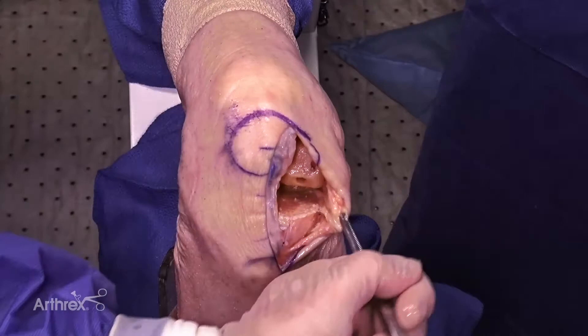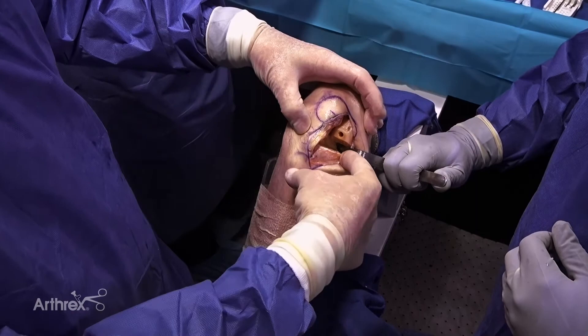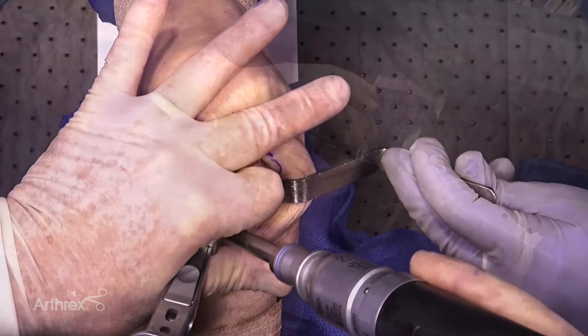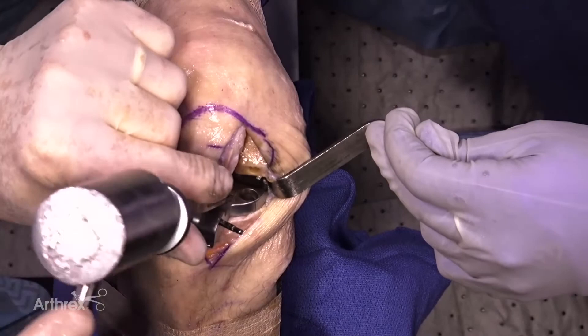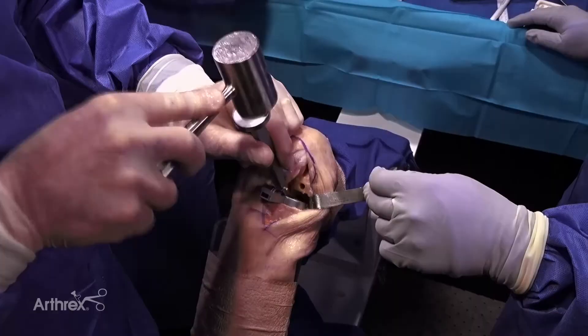Femur's done — now we're turning our attention to the tibia. I take the Z retractor and reflect any tissue away because I want to be on the posterior medial corner. I externally rotate the tibia just a little bit. Through a small incision with adequate reflection back to the posterior corner, we have a nice view of our entire cut surface of the tibia. I use a size-two tibia, place it at the very back corner, pin that into place, and make sure it's flush. Then the lug drill — two lugs, one keel — making sure it doesn't lift off, as it will with hard bone. You can hear a pitch change when you're down, and check the laser mark to confirm. Take that out.